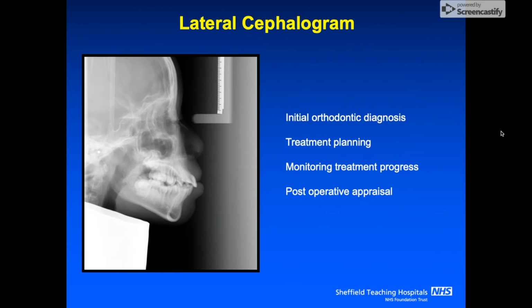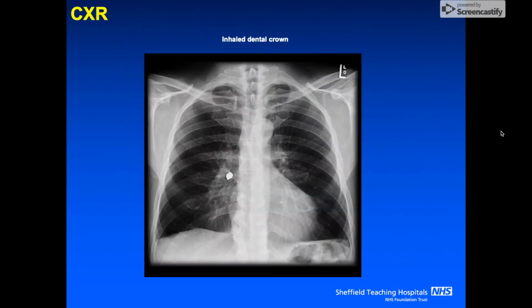This technique is used extensively in orthodontics to assess the relationship of teeth to the jaw and to the rest of the facial skeleton. The main clinical indications include initial orthodontic diagnosis, treatment planning, monitoring treatment progress, and post-operative appraisal.